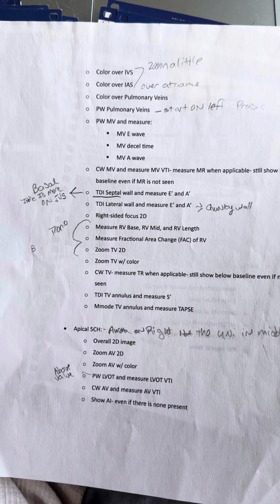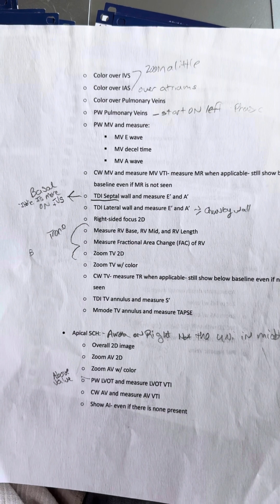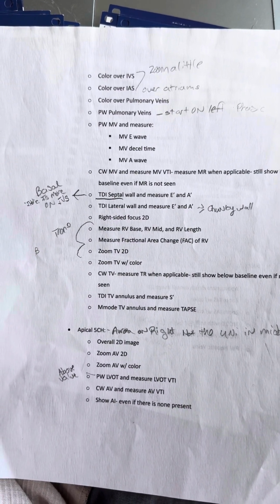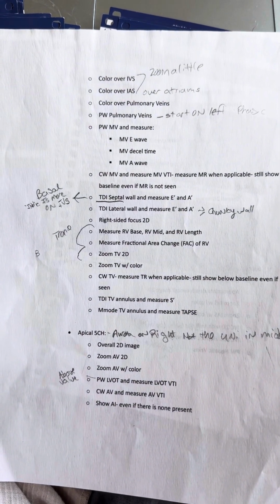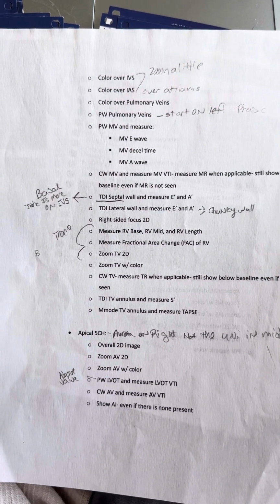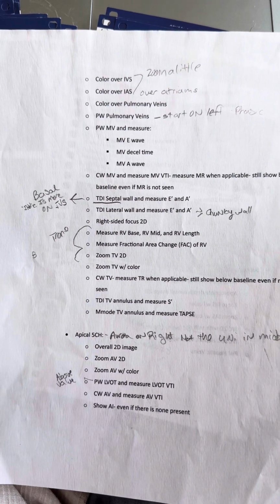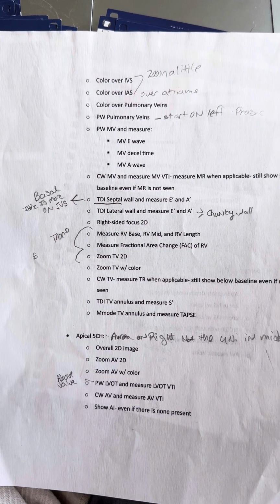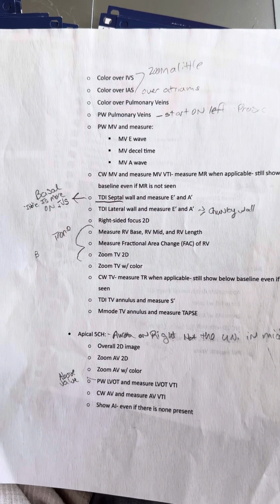Next, we do the pulmonary veins, and you want to do the left pulmonary vein. Put the pulse wave through the left one. Next, you go back to your mitral valve and put a pulse wave through it.